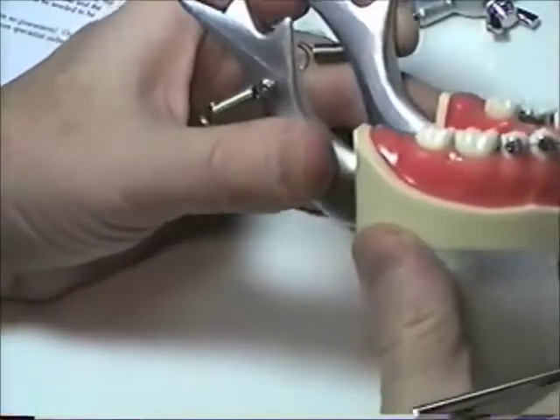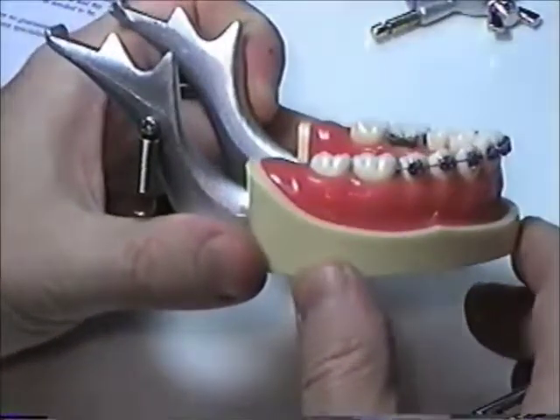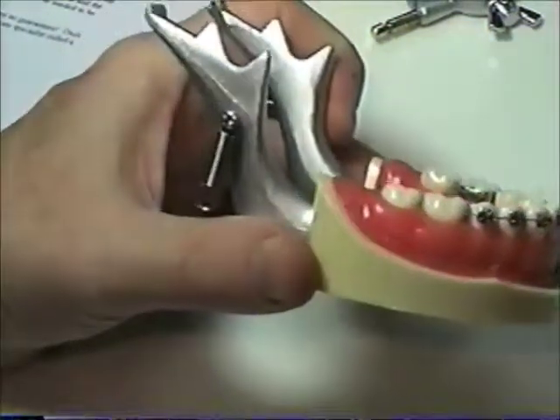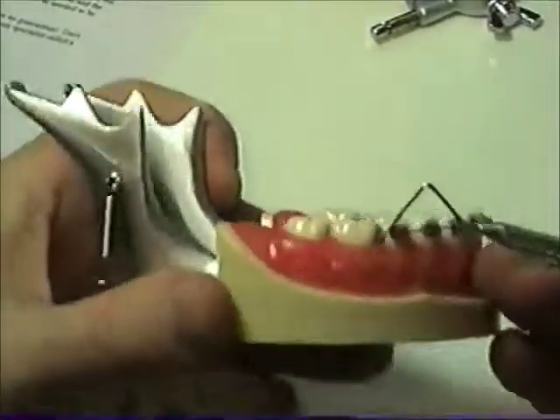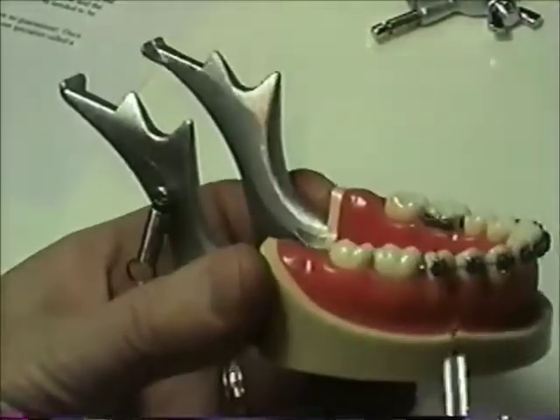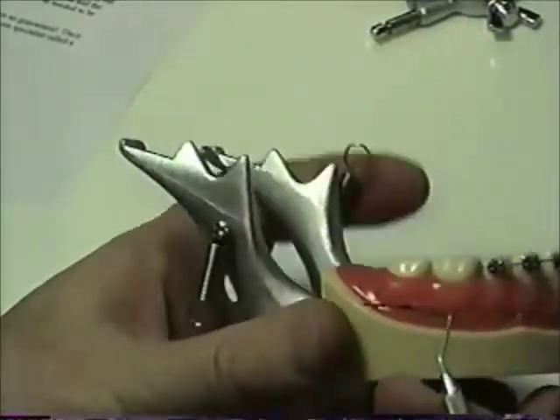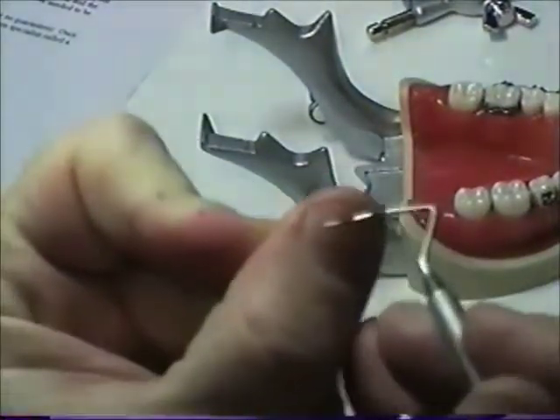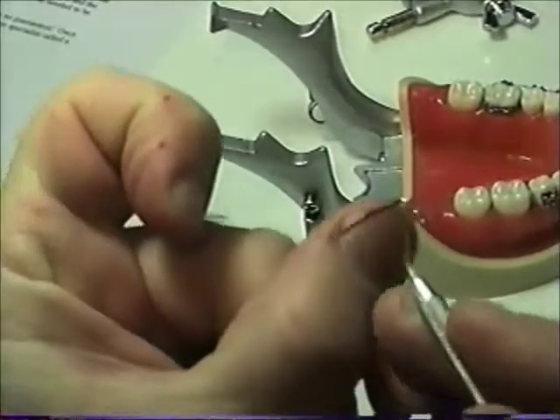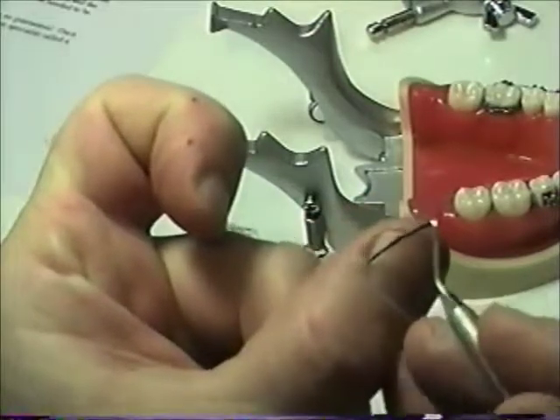So the next thing we're going to do is move on to understanding how you're supposed to spray the water when you Waterpik. But before we get to that, you need to understand something. This is a model of lower teeth, and this is a very good model because it actually has rubbery gums just like we have. Let me show you something on your thumb you may not know. If you look at your thumb right here, your skin comes up and then folds over, and there's literally a pocket formed here.